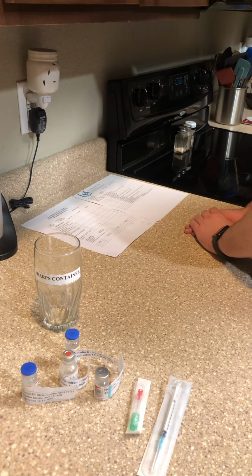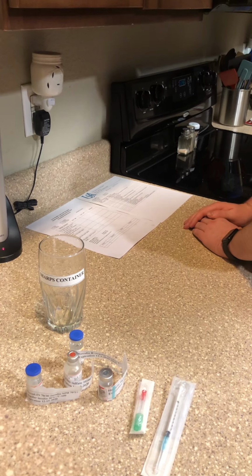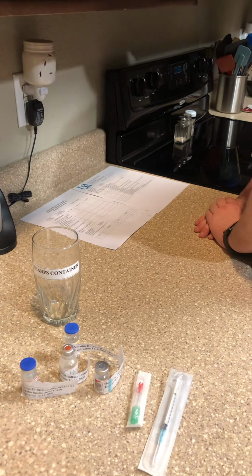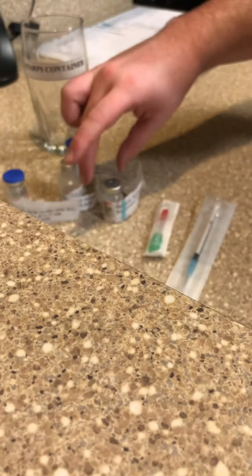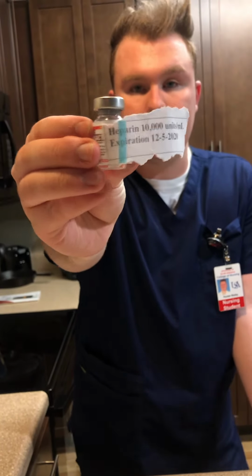Now I'm going to verify any allergies. It says that he is allergic to penicillin. Allergies, penicillin. So now I'm going to perform hand hygiene, wash my hands, and select the correct drug. Selecting the correct drug, I'm going to select heparin, and the expiration date is December 5th, 2020, so it's good to go.